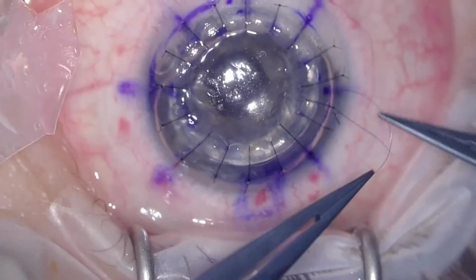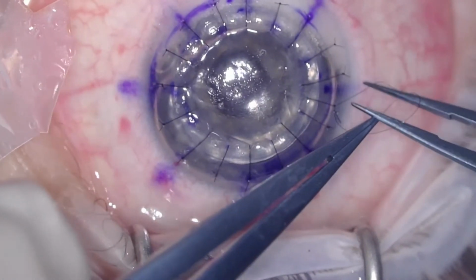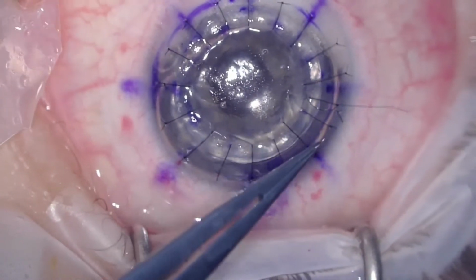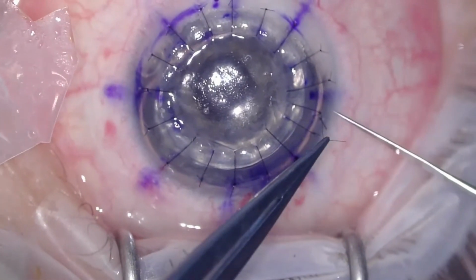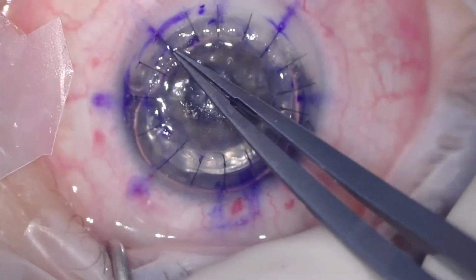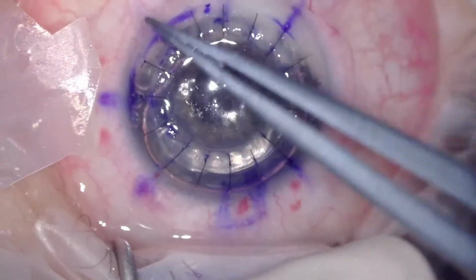And you can see the eye's under a little bit of tension, so you need to release some of this gas afterwards. So while you're tying your last suture and while you're rotating the sutures in place, you can keep the gas at this tension while that's happening, and that allows for the Descemet's to oppose up to the donor cornea a bit better. And here you can see I'm just rotating the knots into position.